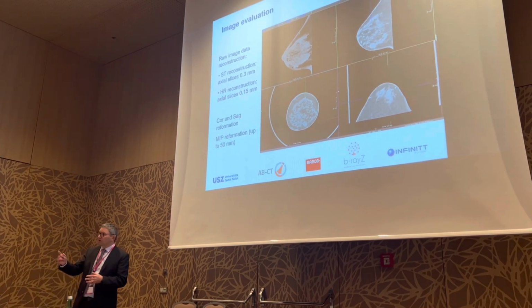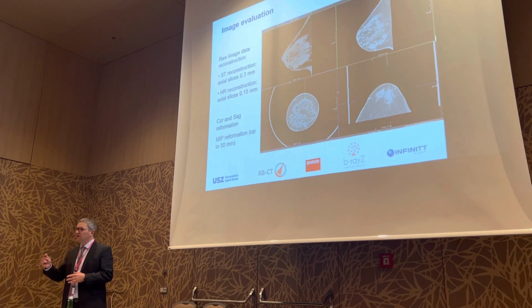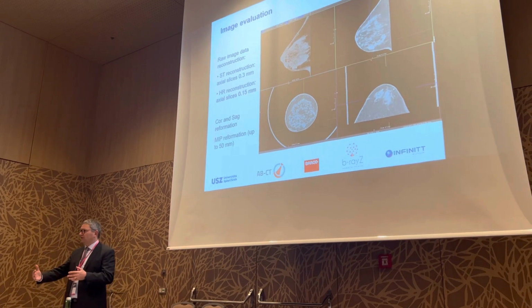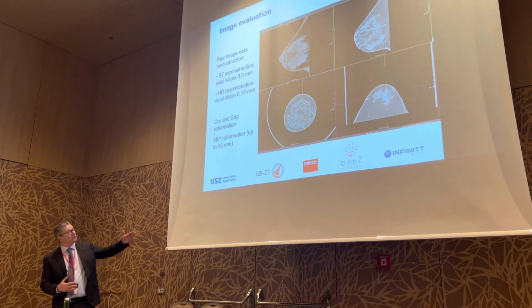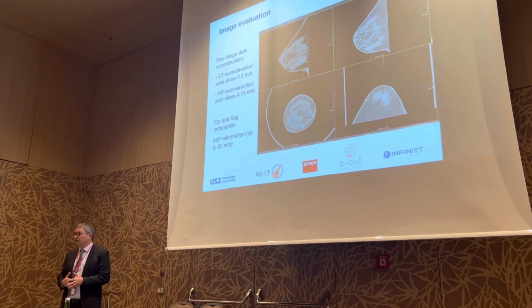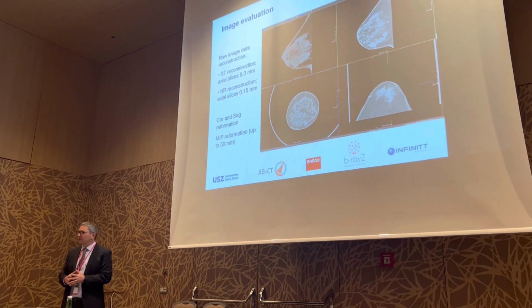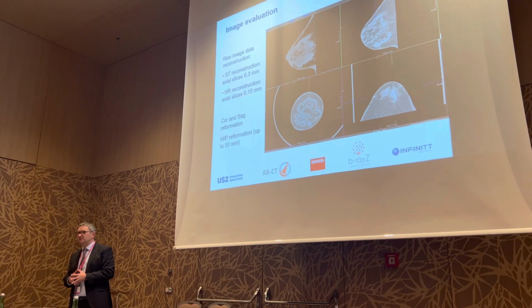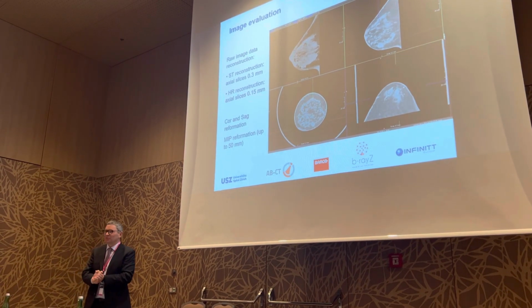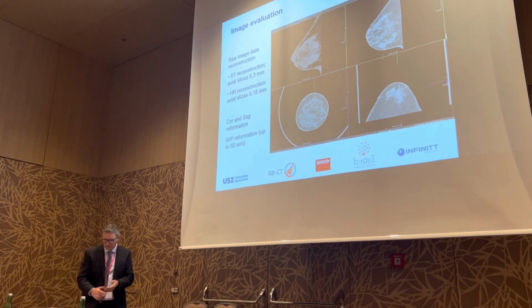But similar to tomosynthesis, it might be more difficult to find those microcalcifications because you have so many images. So therefore, it might be helpful to use MIP reconstructions to find those microcalcifications. And this can be done also with this PACS system. You can ask our colleague there if you have problems or if you want to try it.